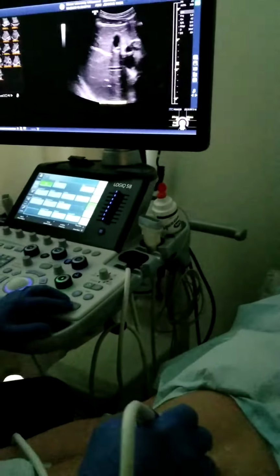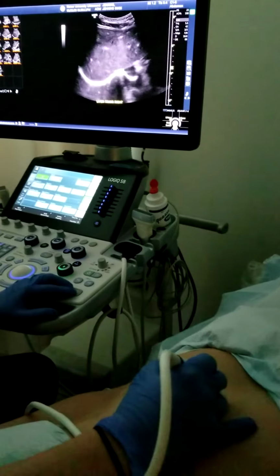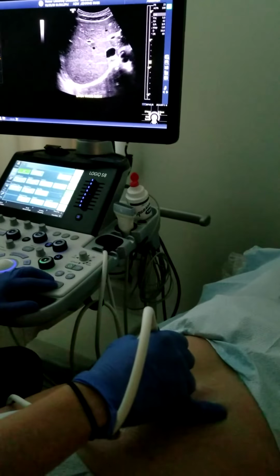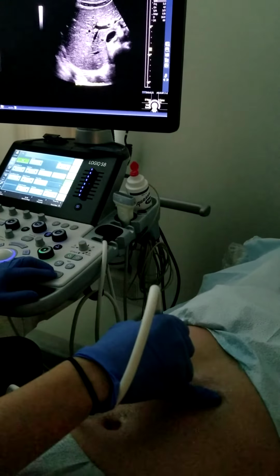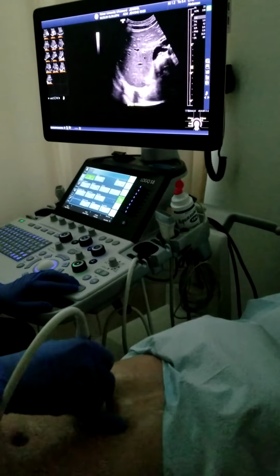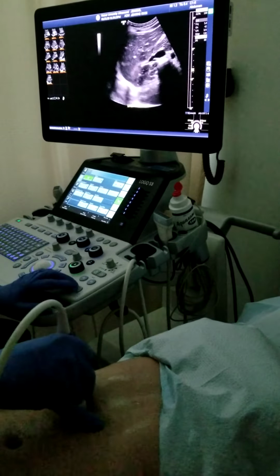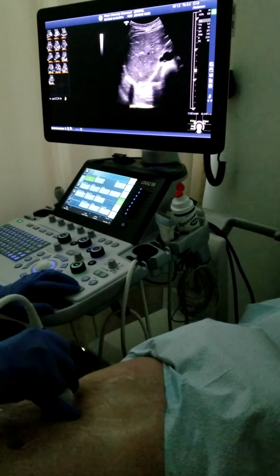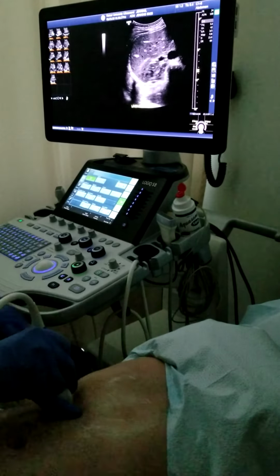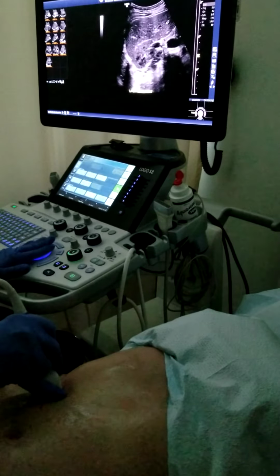All right, my next image is going to be the liver and kidney interface. So let your patient breathe. And when you're ready, take another breath in. So I'm still subcostal here. I'm coming down through the liver, and then keep coming inferiorly, because I know that my right kidney is underneath my liver, so keep sweeping down, down, down until you start seeing your kidney come into view. And then if I want to change my window to get a little prettier picture, I'm going to just follow the ribs around. Freeze, breathe.